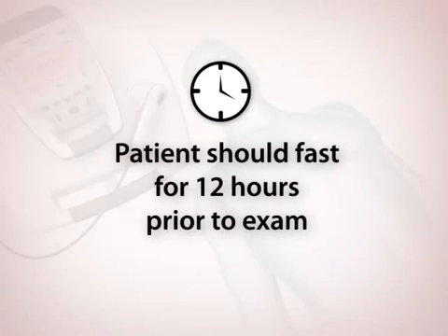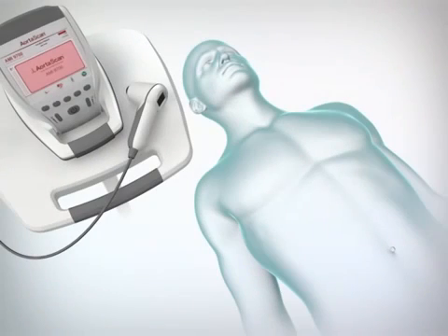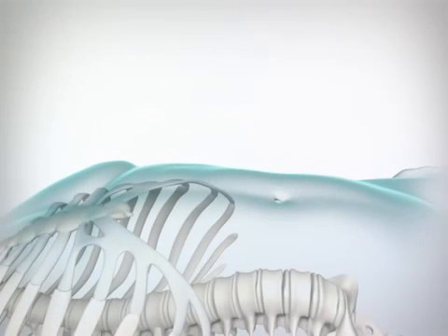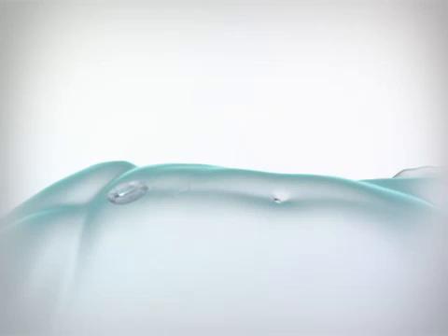Because the presence of bowel gas may contribute to an inaccurate exam, it is ideal to have the patient fast for 12 hours prior to an exam. Start with the patient in the supine position, with abdominal muscles relaxed and arms at the patient's sides. Identify four scan locations, equally spaced, along the midline of the abdomen between the xiphoid process and the umbilicus. Place an ample quantity of ultrasound gel midline on the patient's abdomen.